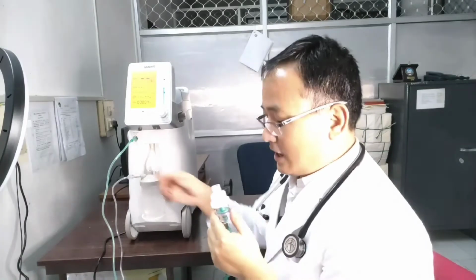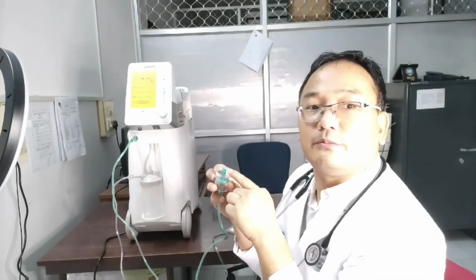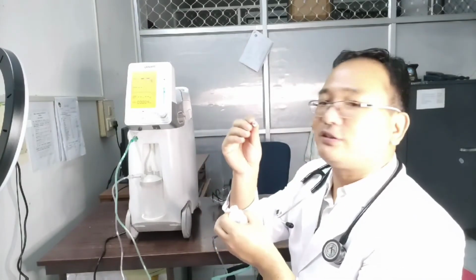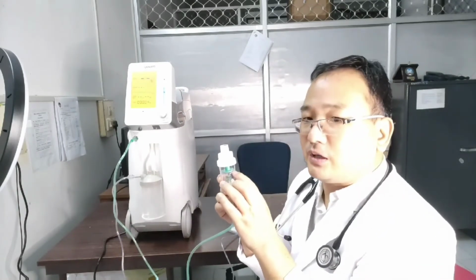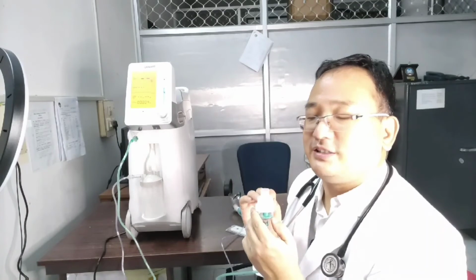through this outlet point, I have connected the tube for nebulization. Here, the nebulization medicines can be placed along with water and connected. This knob you have to place properly, otherwise you may lose it. So I keep it here. Here the solution like salbutamol, ipratropium bromide or any other drug which is advised for nebulization can be placed with the water and make a solution, and one can then nebulize it. There will be a nebulizing mask here, so that is to be placed here for nebulization.